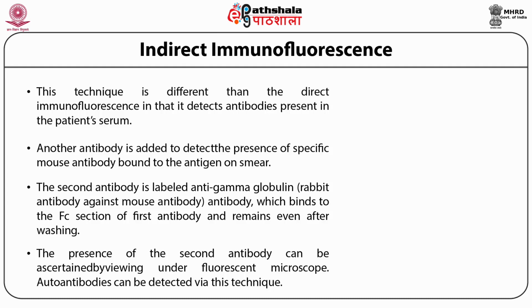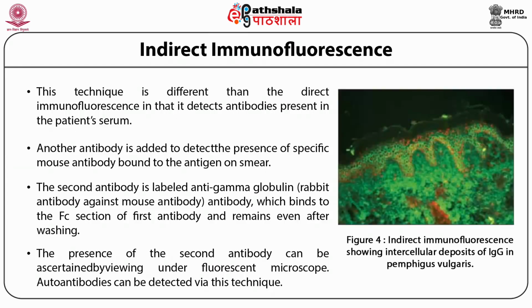Autoantibodies can be detected via this technique. Additionally, this technique is widely employed for detecting anti-nuclear antibodies, that is ANA, which are observed in SLE patients' serum. The figure shows the indirect immunofluorescence, which is showing intercellular deposits of IgG in pemphigus vulgaris.